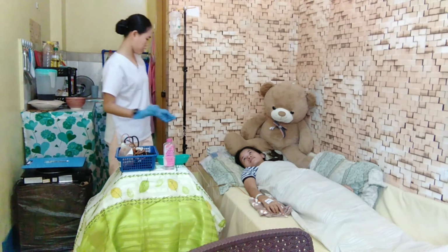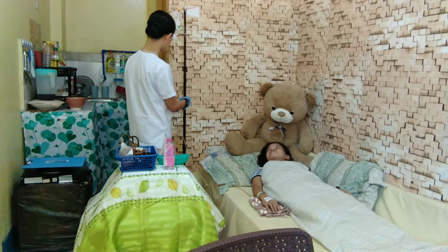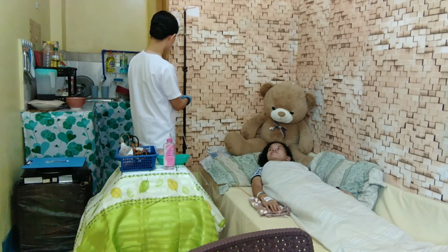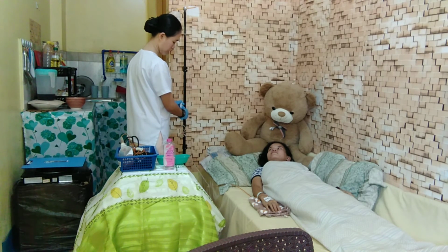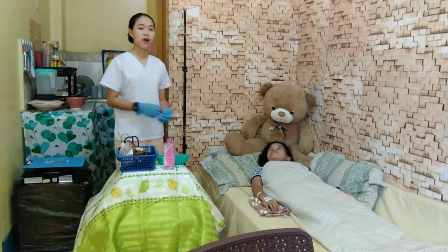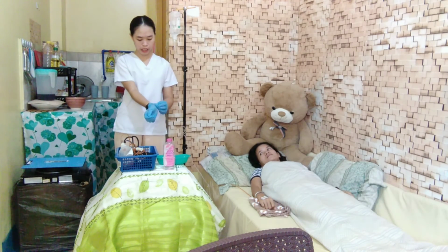And also, we will now start infusing the IV solution, which is 0.9% normal saline PNS, to the patient. After that, you will remove and dispose of the gloves properly.